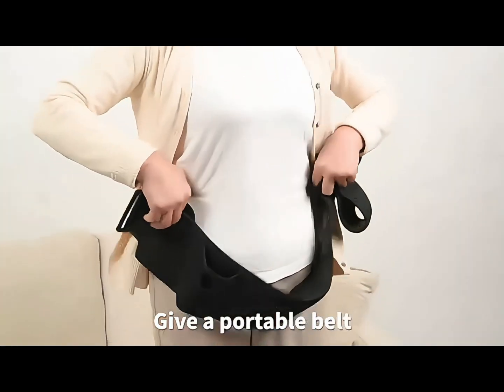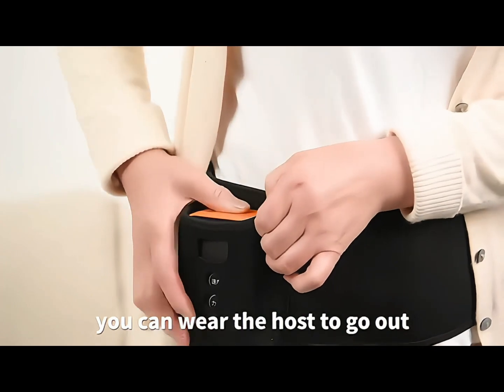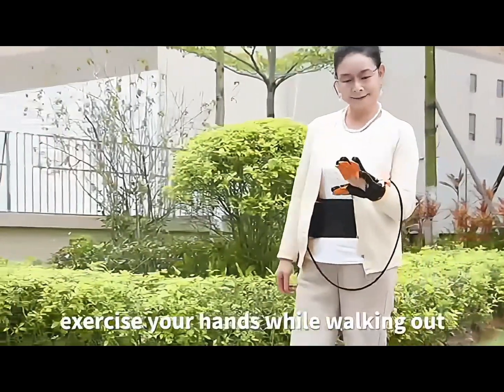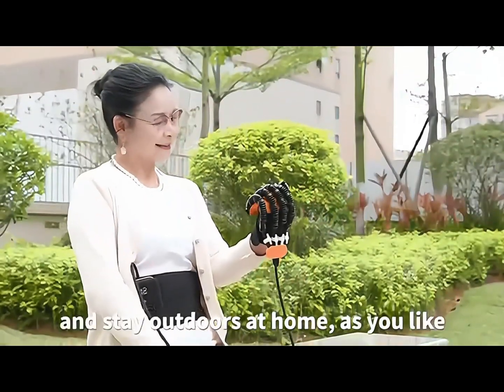Comes with a portable belt so you can wear the host to go out. Exercise your hand while walking out, and stay outdoor or at home as you like.